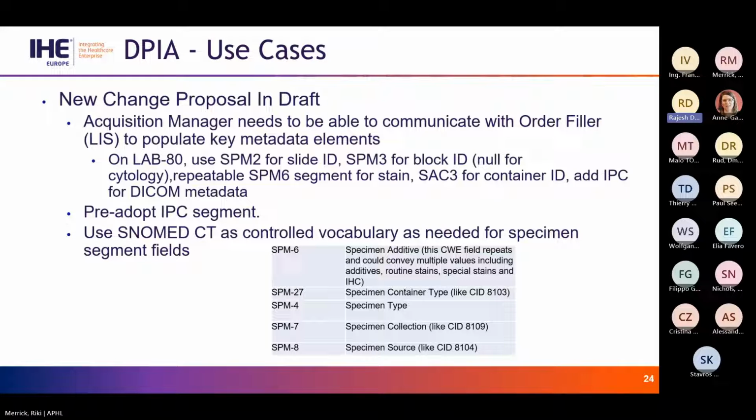Okay, so one of the things that was necessary was recognizing that as the whole slide image is being created, there needs to be some communication between the software that's generating the whole slide image and the LIS to populate key metadata elements. And so we've been working these through on our calls, and we've come up with some proposals. We would welcome feedback as well as engagement to make sure that we are proposing in this change proposal something that will work for your software system if you're implementing digital pathology. And here's a preview of things to come.